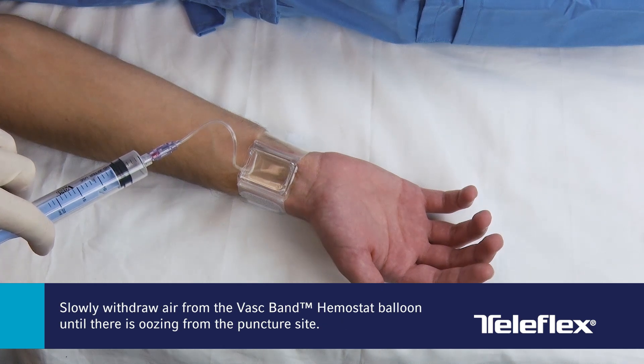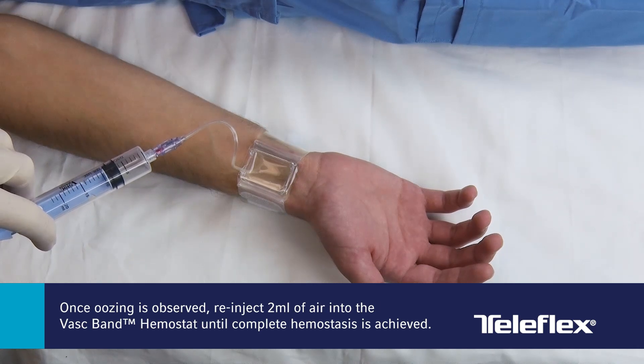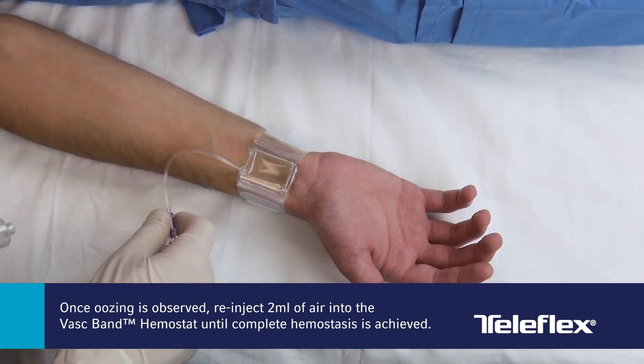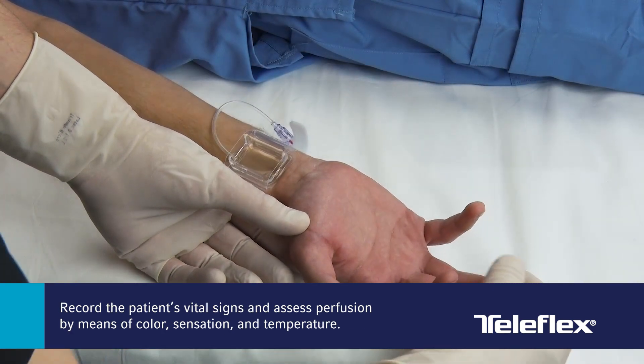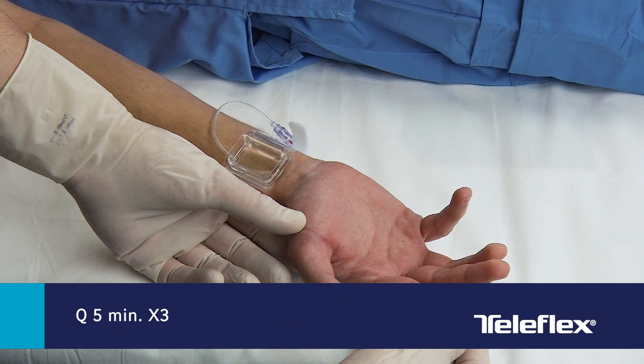Slowly withdraw air from the VASC-Band hemostat balloon until there is oozing from the puncture site. Once oozing is observed, re-inject 2 mL of air until complete hemostasis is achieved. Record the patient's vital signs and assess perfusion by means of color, sensation, and temperature every 5 minutes for 3 times.